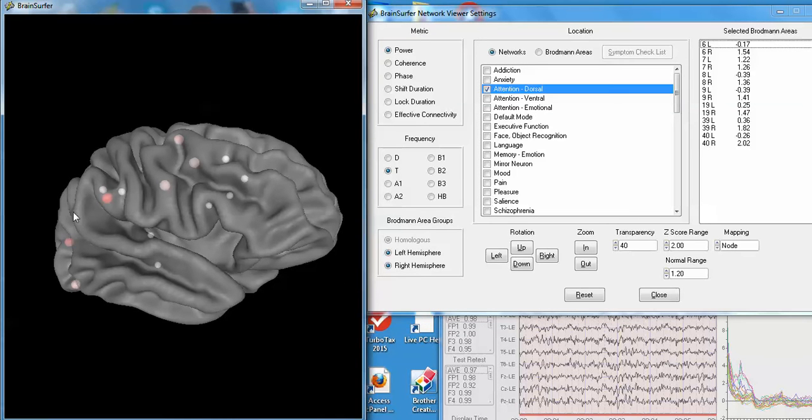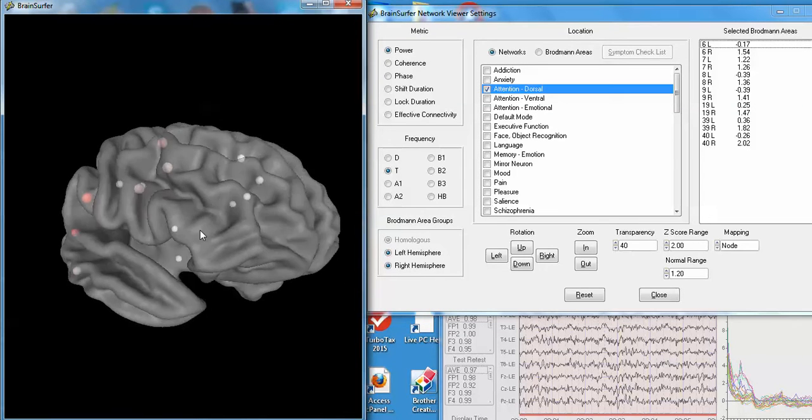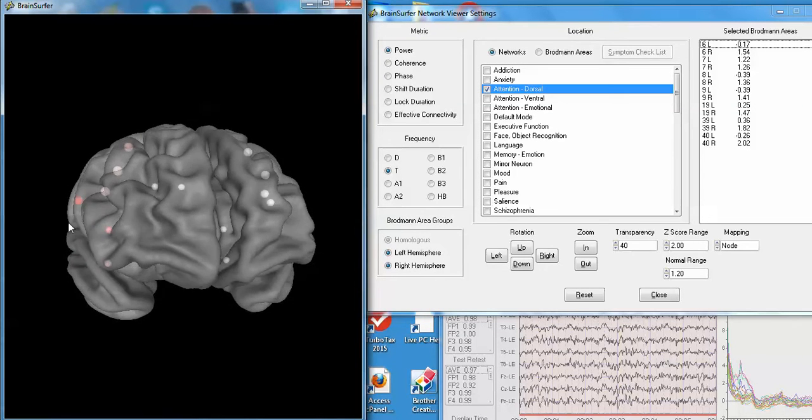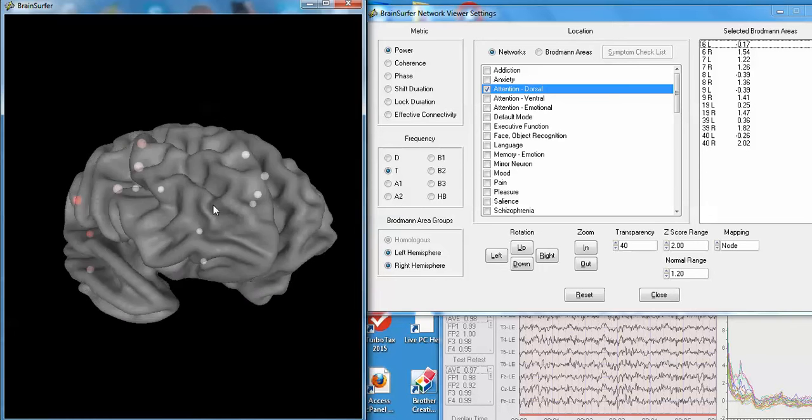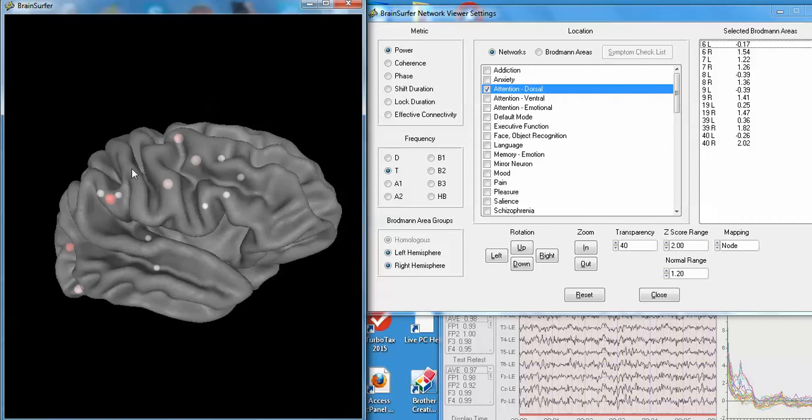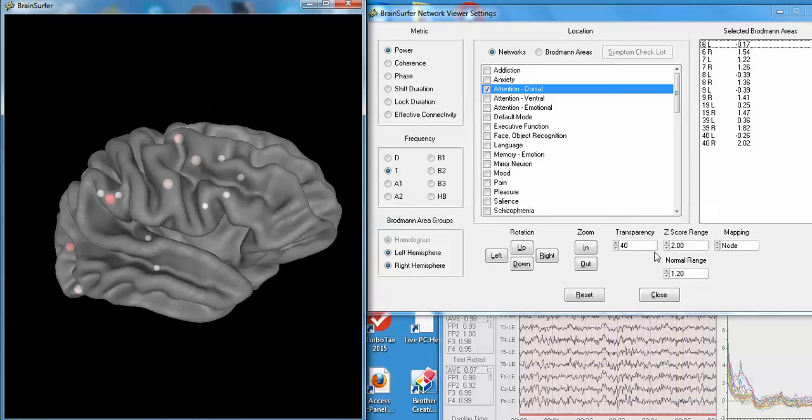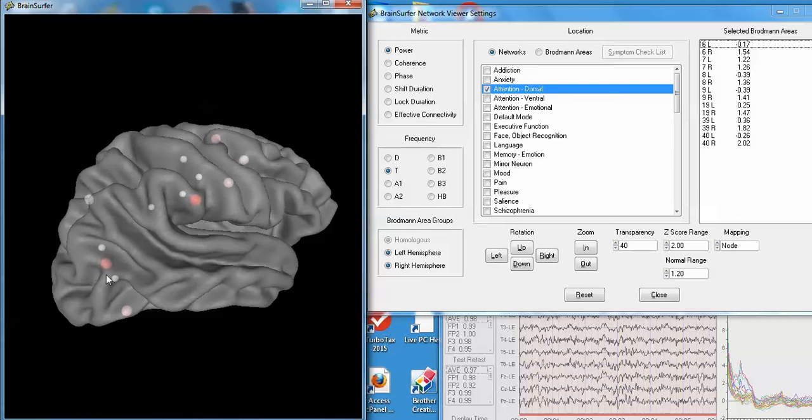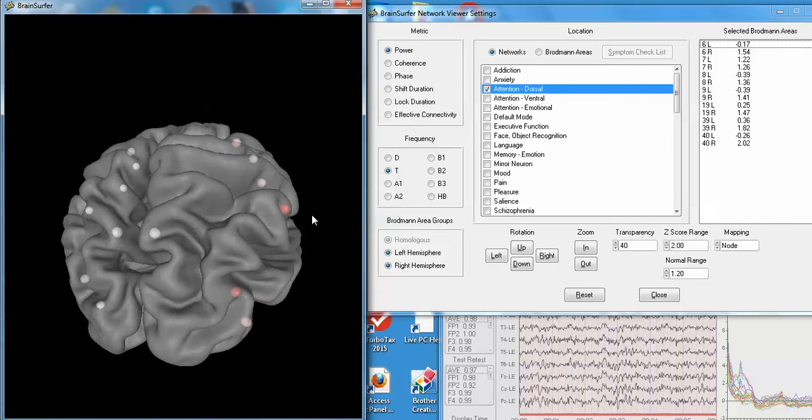Each sphere here is a Brodman area as part of the dorsal attention network. You can see that the red colored spheres actually represent two standard deviations outside of normal. Here you can set the z-score range that you want to look at. You can change transparency, zoom in and out, and you can rotate the brain and examine the various parts of the network.